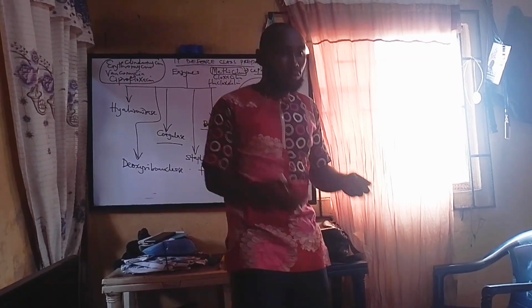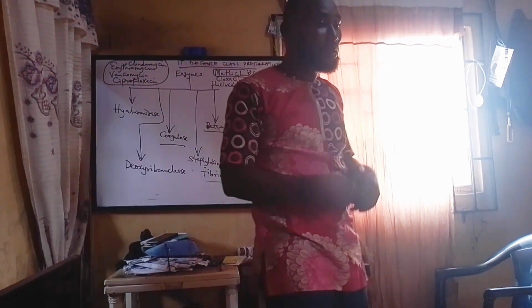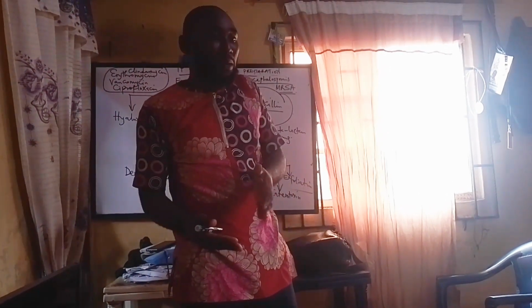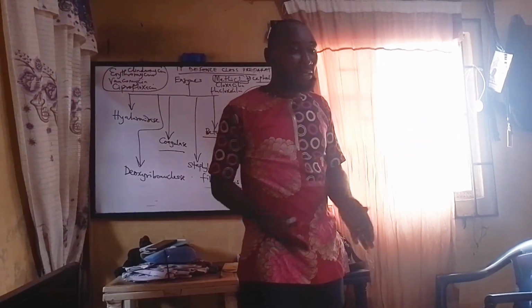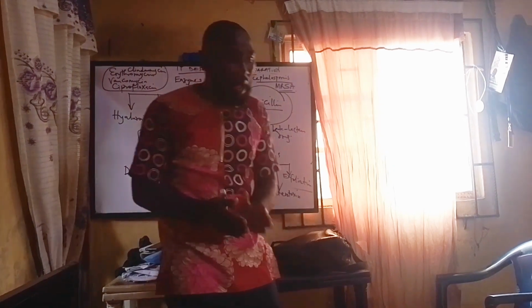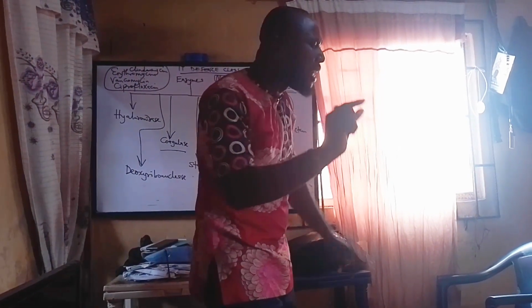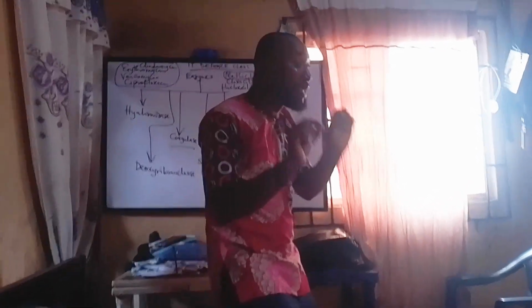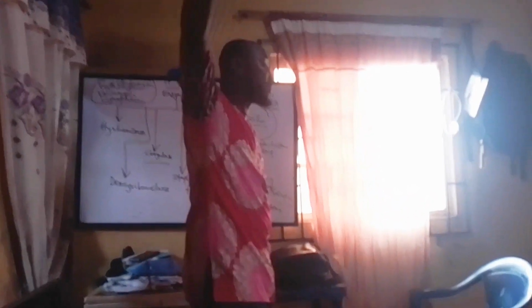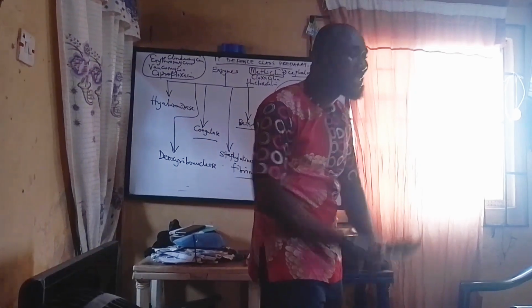So you now explain. Urine sample was collected, because it's not just culture, please. You can say you want to discuss urine MCS. For example, I'm not telling you to discuss staph. I want to discuss urine MCS, meaning urine microscopy, culture, and sensitivity. So now that urine, there are rules, not just any urine. Hope you know, a freshly voided urine, not urine that has stayed for 5 days that you now bring. You must see something normally, because if you leave urine for some time, bacteria will deposit inside.